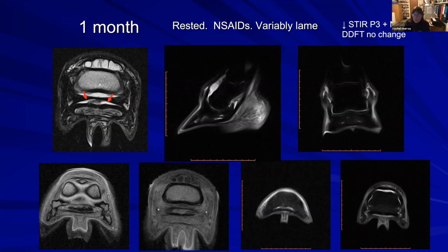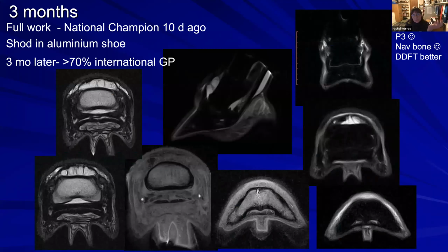So although the lesions in the navicular bone and in the deep digital flexor tendon are not significantly different, we've got soft tissue that's evident now, and we've got significant change in the bone. So at 3 months, this horse is re-MRI'd again prior to going back into full work. We've got a deep digital flexor tendon. These are evident, but primarily only on the T1 images now, with the soft tissue present here, and our bone fluid signal has resolved completely. So this is 3 months from where we are.